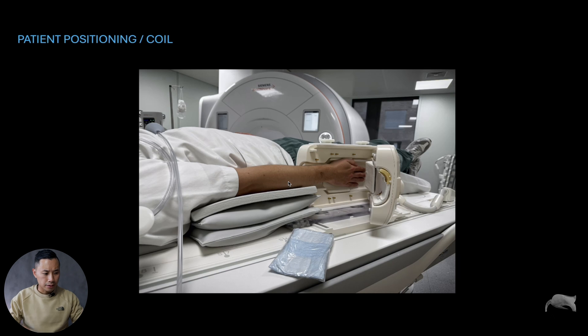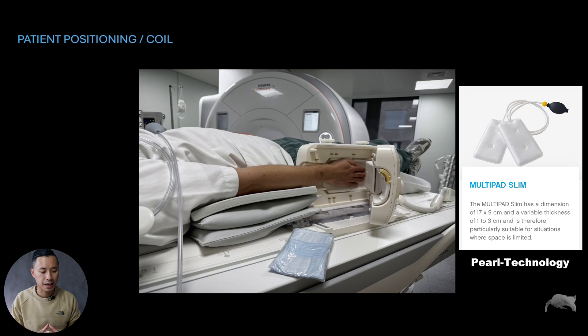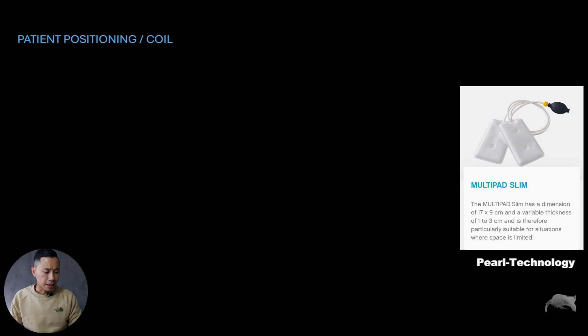When you open the coil, you can see it's 90 degrees here — the arm is straight along with the wrist and fingers. The fingers should be as close to each other as possible. We use different pads; you can see the pads are worn and out of shape from years of use. We also have an oblique pad for the fingers so when we close the coil it will fixate the fingers. We use a combination of made pads, Siemens pads, and Pearl Tech pads — very useful.